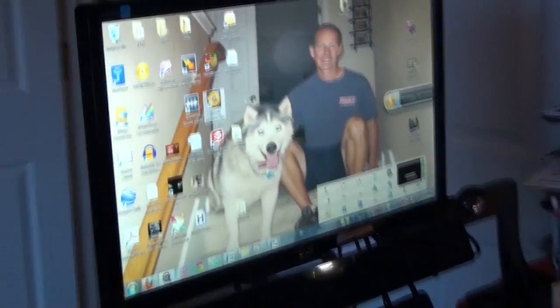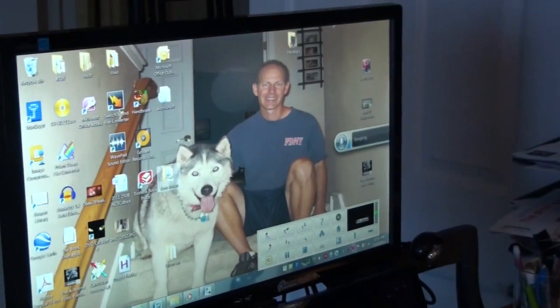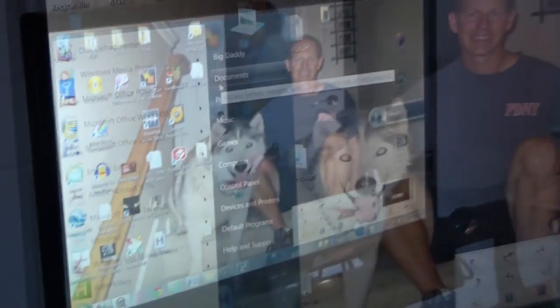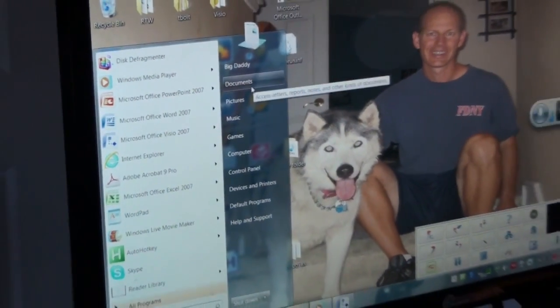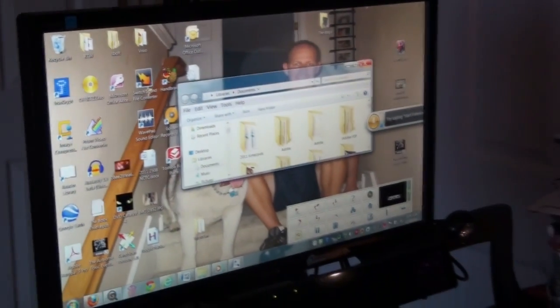I've got control with my eyes now, with a mouse, and let's say I want to go and I want to look at a document. So I want to go to documents, so I'm going to look at it, I'm going to click, and it opens my documents.